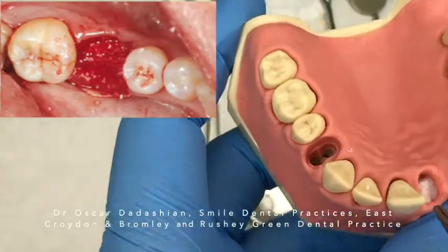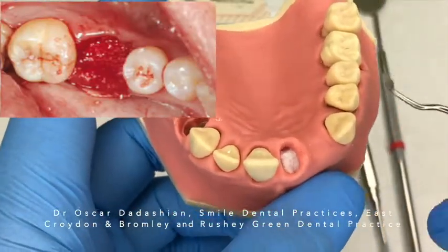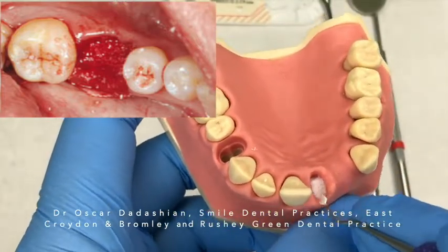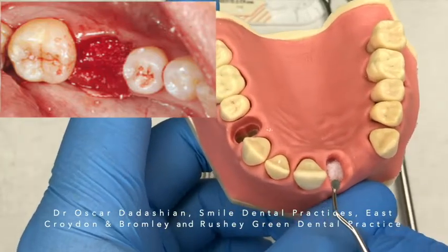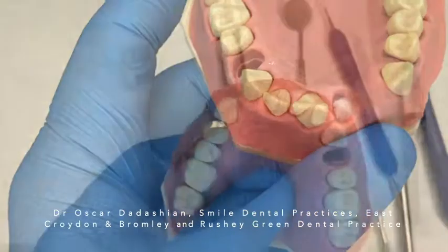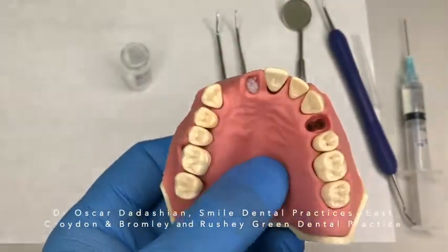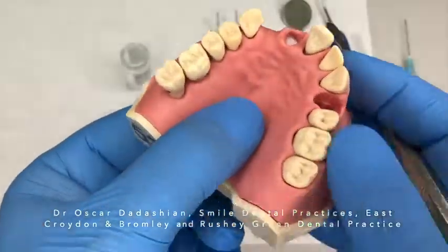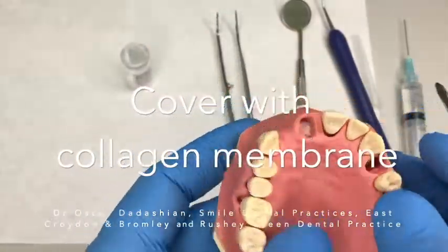It is very important that you have blood covering the material. You don't want the material to be showing or look white — you want it covered with red blood cells. If you don't have enough bleeding, make sure you encourage bleeding. Please do not overfill your socket. You just want to reach the bony wall, not all the way up to the gingival margin. You need to leave enough space for your collagen membrane to cover it all.